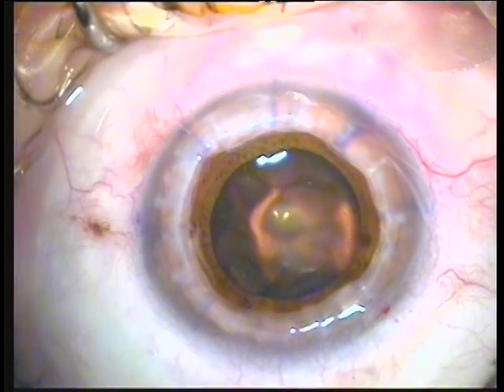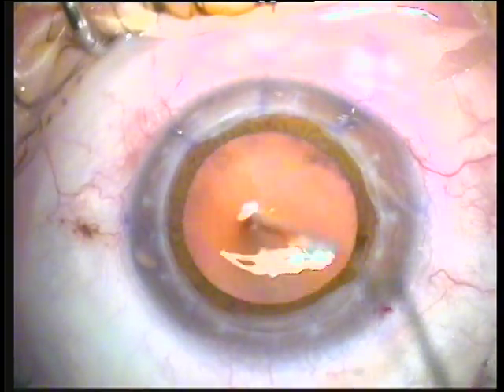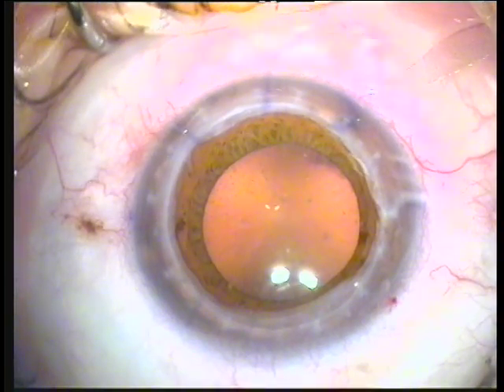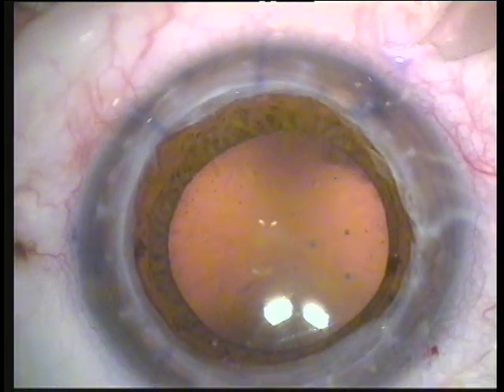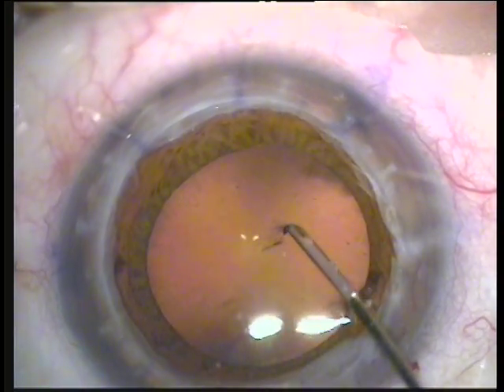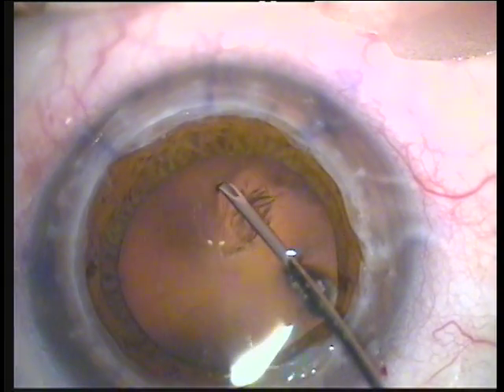The patient is under perfect general anesthesia to attempt a continuous curvilinear capsulorrhexis. Of course, this is quite a stressful procedure as it is performed open sky, and any movement or squeezing from the patient may predispose for an ominous suprachoroidal hemorrhage and expulsion of the intraocular contents. We're going to go ahead with a cystotome and perform a continuous curvilinear capsulorrhexis as you'll see here, open sky with just BSS present over the anterior capsule.